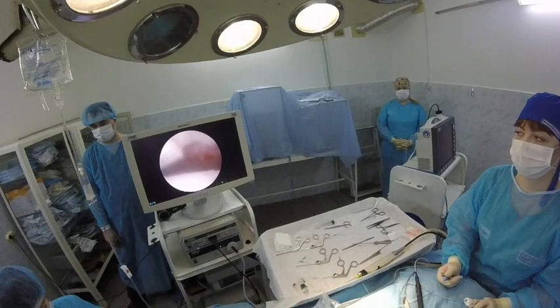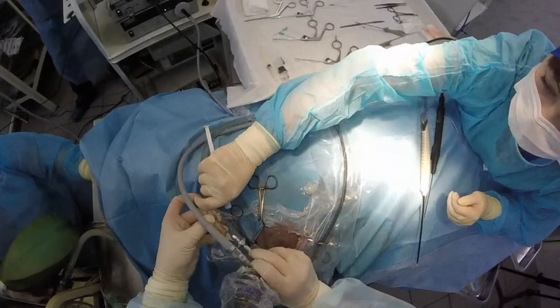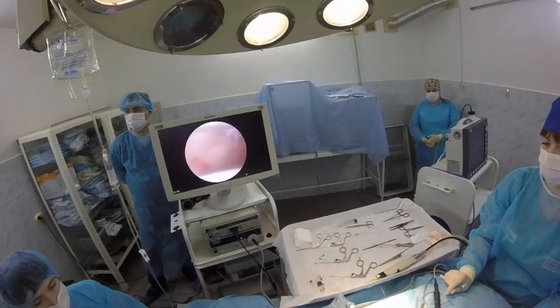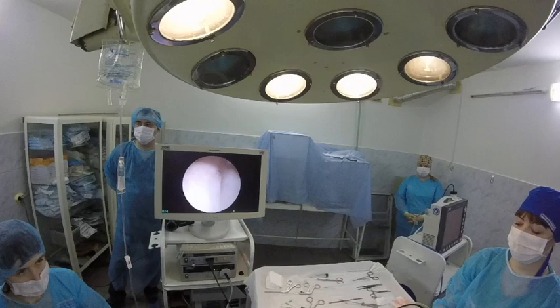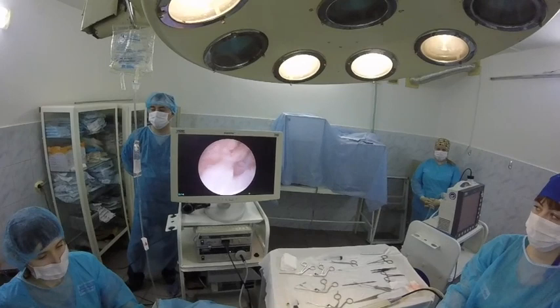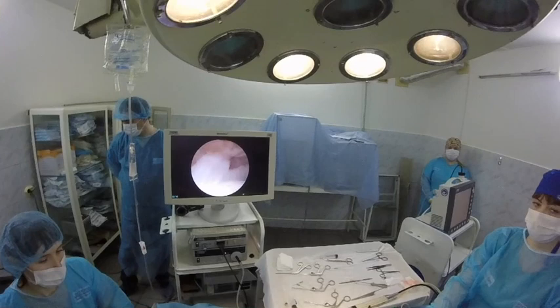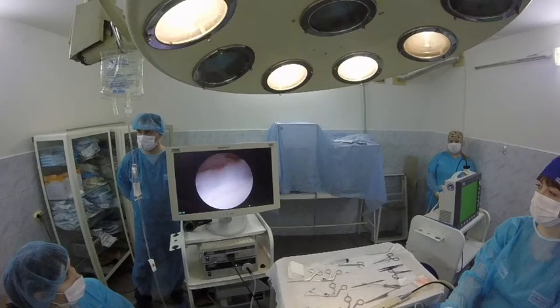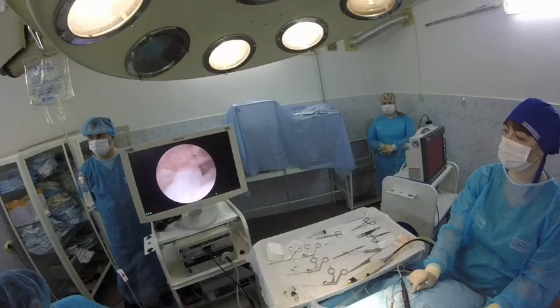This is our fragment — it was here, and now we need to check our joint because sometimes we lose an osteochondral fragment — we call it a mouse. Try to check it here. This is the fragment which we removed. This is the medial compartment.